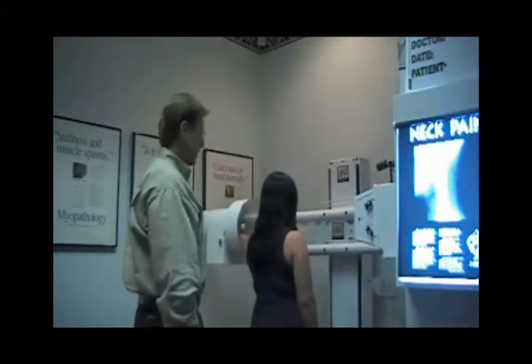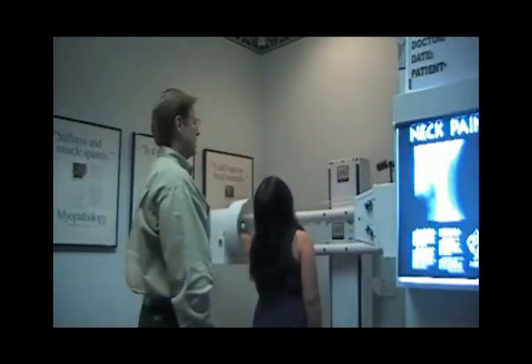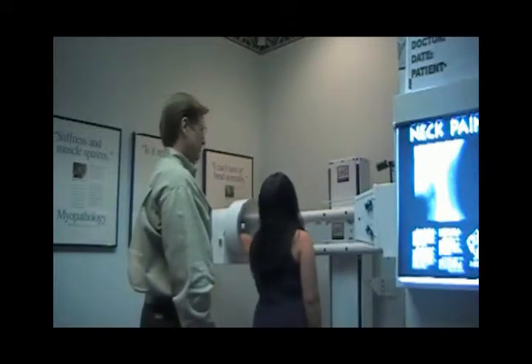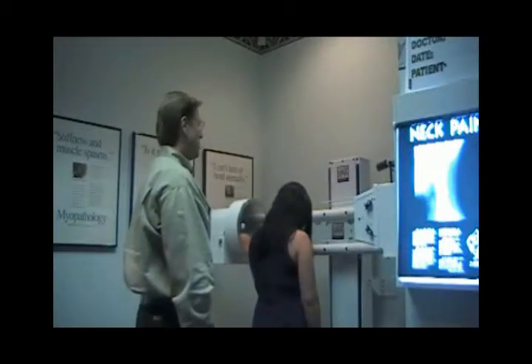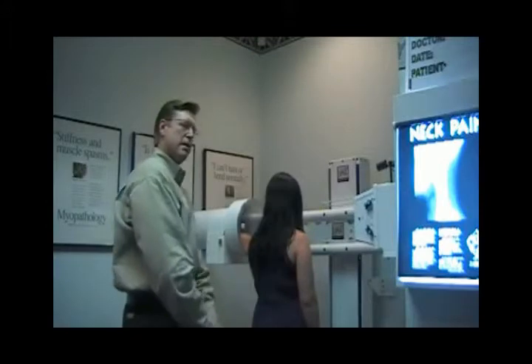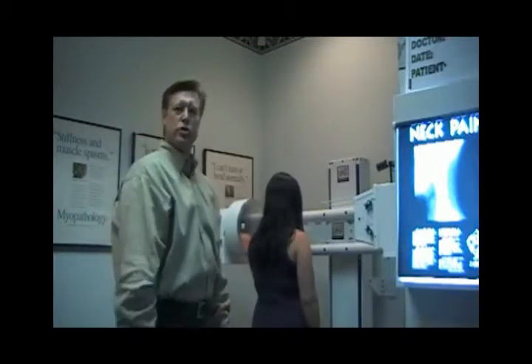Go ahead, Rachel, bring your head all the way down as far as you can, and all the way back up, and back down all the way, and all the way back up, and head down one more time all the way, and all the way back up, and back looking straight level. Perfect. That's the complete flexion extension DMX study. Next, we're going to show you what it looks like.